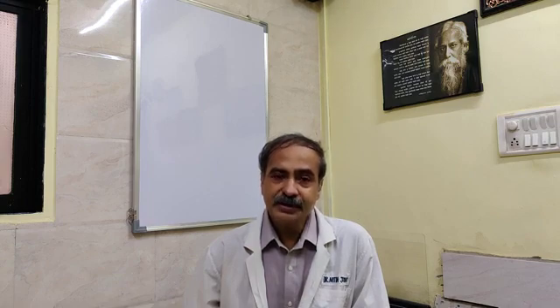Now what is the principle of Mormai's fourth step? According to Mormai, the resection should begin at the 5 and 7 o'clock of the floor sector. Normally the floor sector at 5 and 7 o'clock is occupied by the median lobe. In case the median lobe is absent, then because of posterior commissure hyperplasia, there is bladder neck elevation.